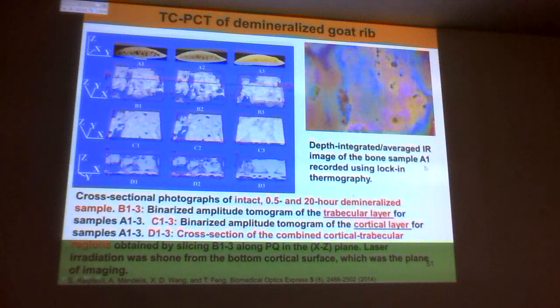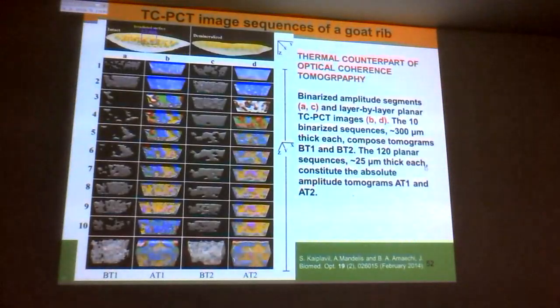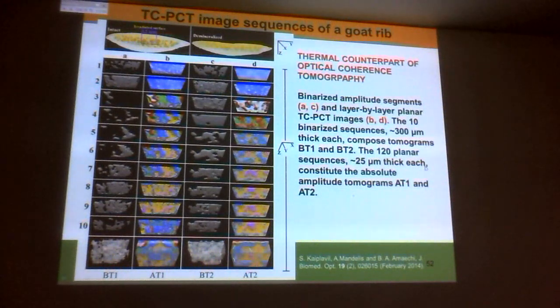This part is this part right here. This part down there is going to be there. You see those aspects, but it is a far cry from what I see with lock-in thermography compared with the resolution that I have there. So in terms of actual resolution, mind you, now I have a microscope interferometer again, and that microscope interferometer is the time slice that moves further down and down and down, and every time, for every location of the slice, I cross-correlate the entire signal with that time delay slice.